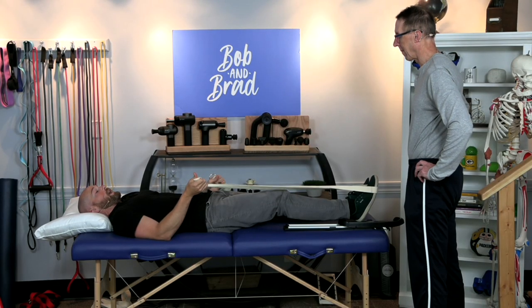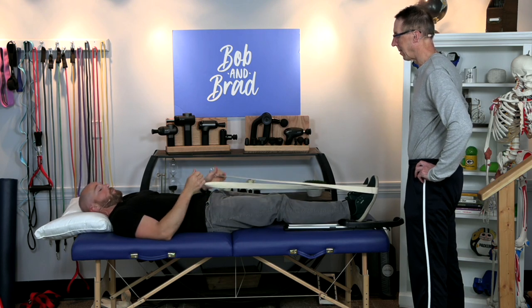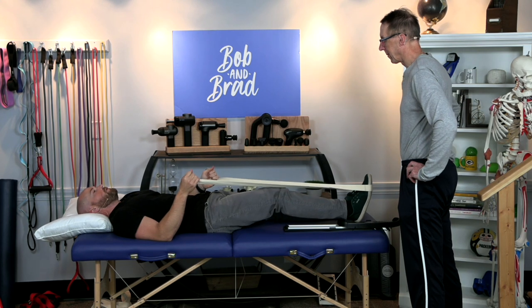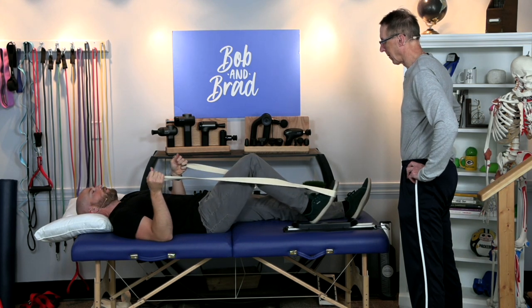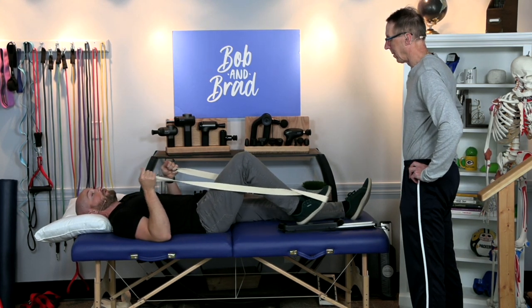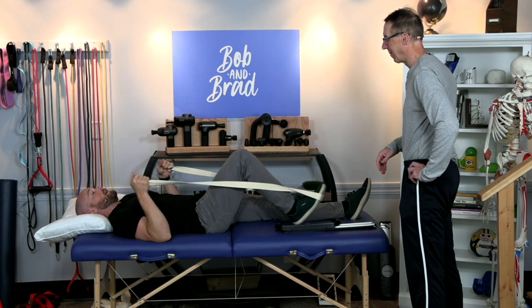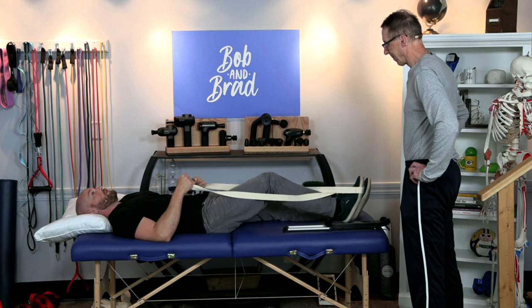We're going to start with this in bed — we have the knee glide on the mat, or this will be the bed. Put a strap around your foot, and you can let the arms help pull or bend your knee for you if you just had surgery, so you can start getting movement right away. That's very important after a knee replacement.